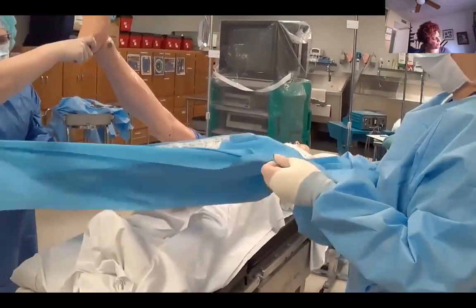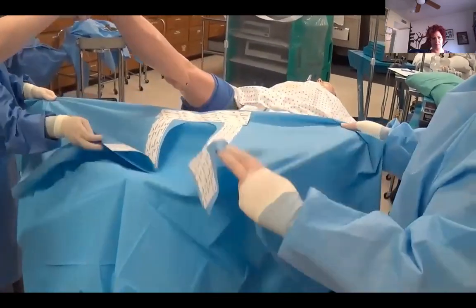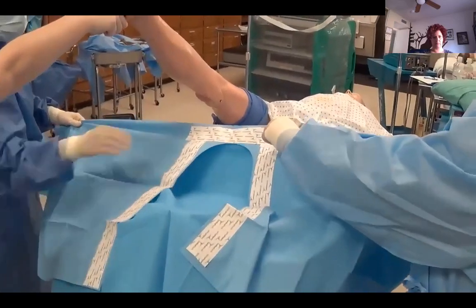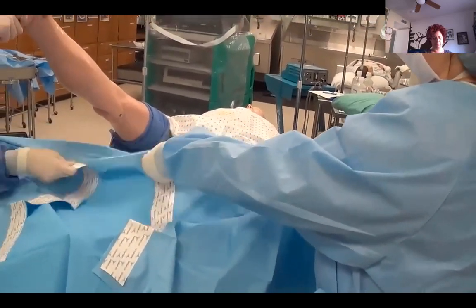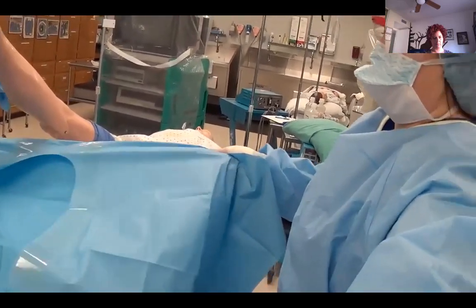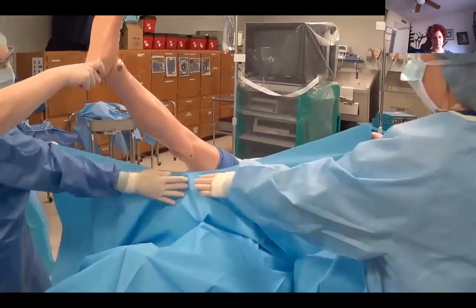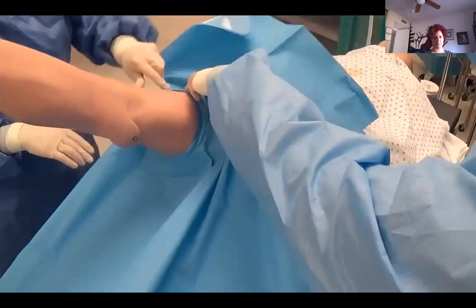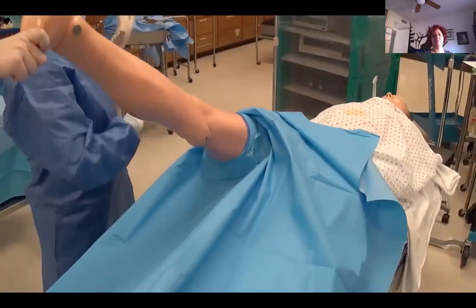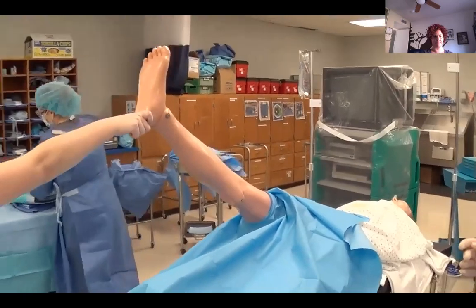You grab the top layer, cup in hand, extend out over the foot of the bed. You hold tension still up here. Pull the tails back, pull the paper off, always from the top down. Then we're going to grab the top of the tail, switch hands, and then grab on the inside of the drape, making sure that we occlude off that towel, and we kind of just bring down one tail and the other tail so that forms that circular type of a fenestration.